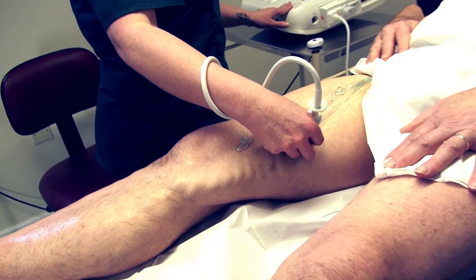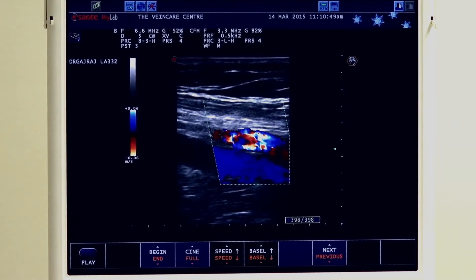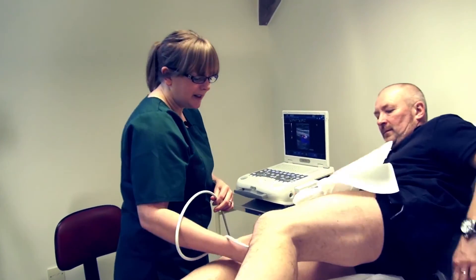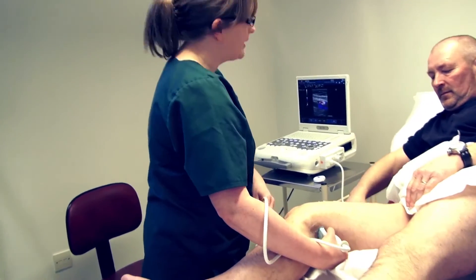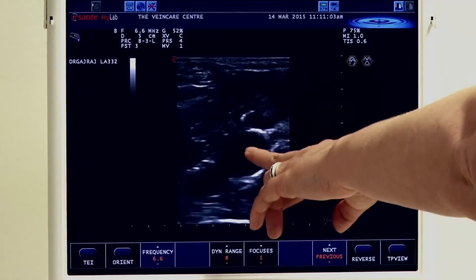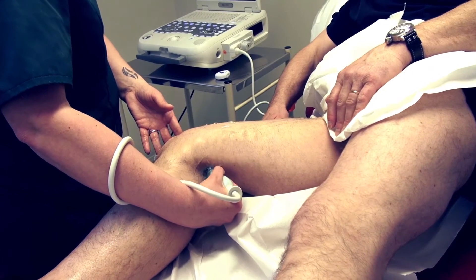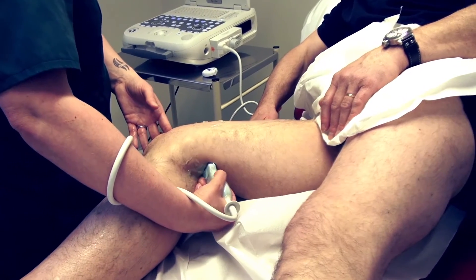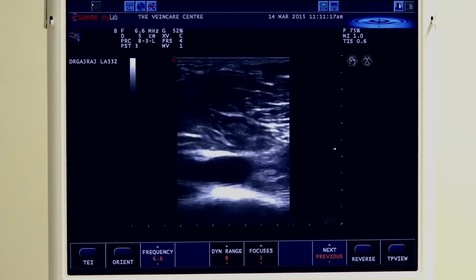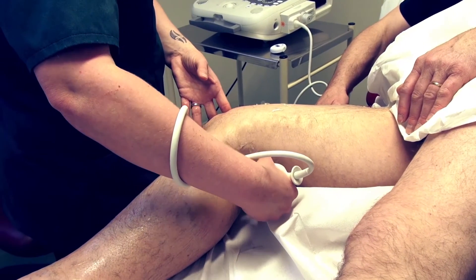We know we have got no above-knee DVTs. So now we need to have a look at the popliteal vein. I am going to get Dave to roll a little bit onto his side towards me. Starting in the posterior knee crease in a transverse position, it is best to pick up the popliteal vein, which we can see just in here. We compress onto that vein to ensure full compression, then come up a little bit higher to ensure overlap with the distal femoral vein, working right the way down into that popliteal vein.